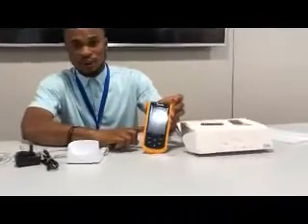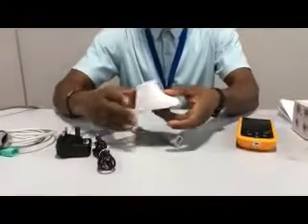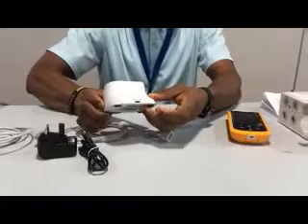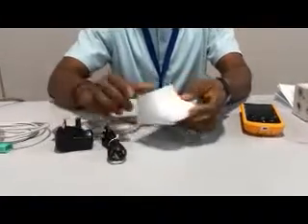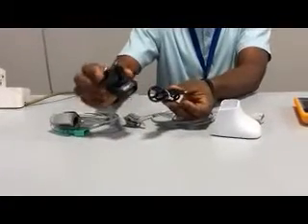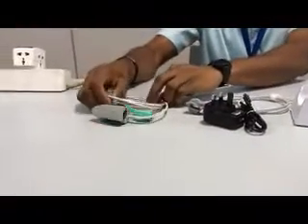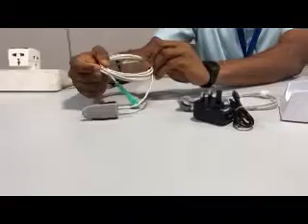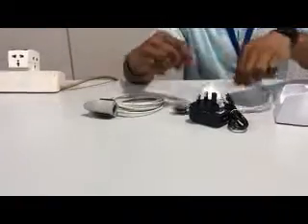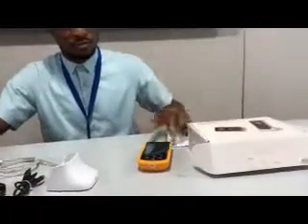Let me describe what I have here before me. I have the unit — the device. I have the base charger. There is a spot here where you can plug the adapter. I have the alternative adapter and cord, USB cord. I have the probe, the SPO2 probe. This is for adults and this is for neonates. And of course, the manual.